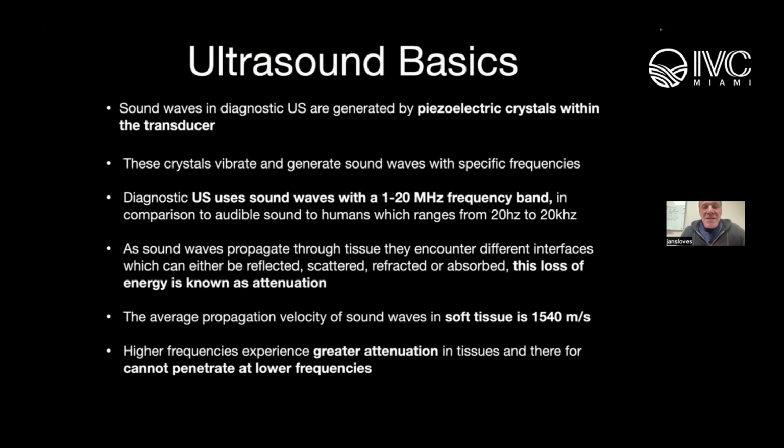Sound waves in diagnostic ultrasound are generated by piezoelectric crystals in the transducer. What these crystals do is they vibrate and they generate sound waves with specific frequencies. Typically in diagnostic ultrasound, when we're looking at the legs, we're using a high frequency transducer, as opposed to when we're looking at the abdominal pelvic vessels, where we're using a lower frequency curved array type transducer.